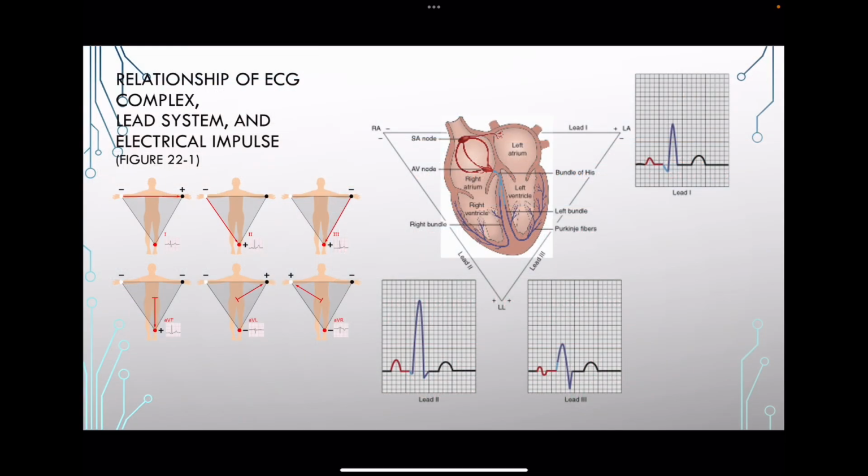All right, so this is just an image of how the lead placement gives you the different views of the heart. I added this photo over here. Obviously, your leads aren't going to be placed on your wrists, but that's the concept of it.